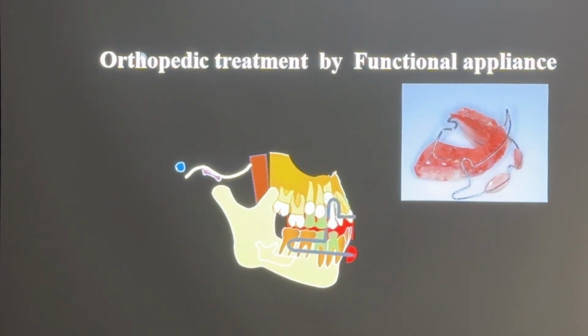The lip pad is just near the tissue surface. At the beginning they need some space between the tissue and the lip pad, a little space. So please don't touch the lip pad to the tissue. Okay, so now you understand how we make the lip pad.